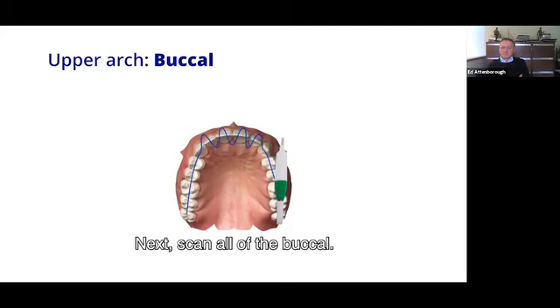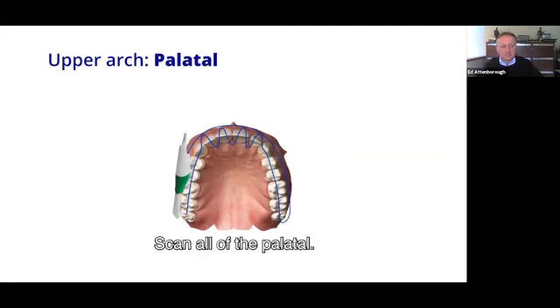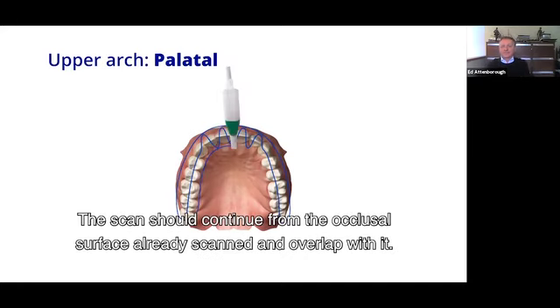The scan should continue from the occlusal surface already scanned and overlap with it. Scan all of the palatal. The scan should continue from the occlusal surface already scanned and overlap with it.